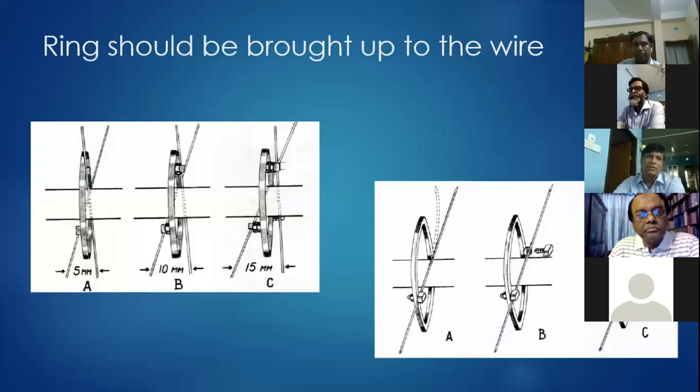And now the ring should be brought up to the wire, but the wire should not be brought up to the ring. So to bring the ring up to the wire, we can use many things like washers or other supports.